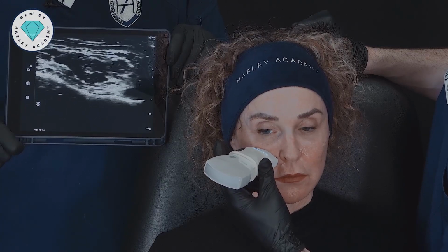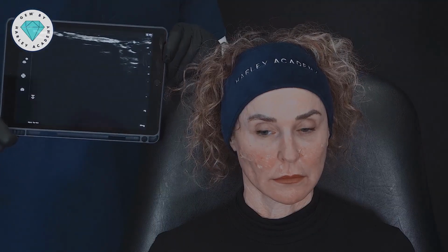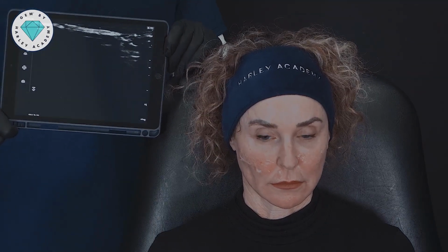Very good. Brilliant. So yeah, as we suspected, where it is. Thanks, Max. So where does that leave us?